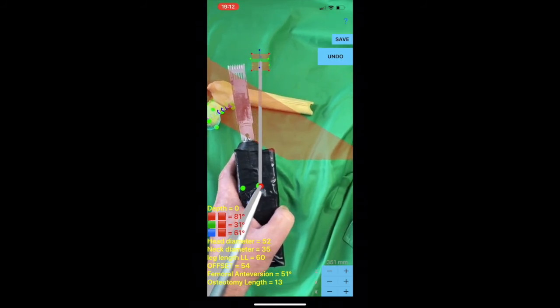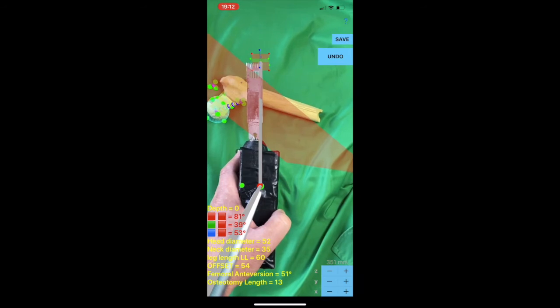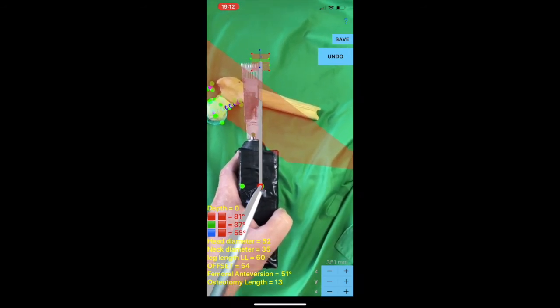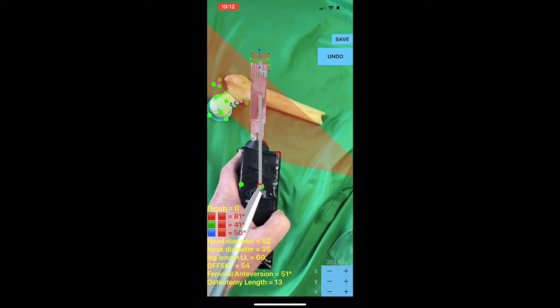Surgeon can view a gray cylinder between two red spheres, rod image superimposed in the real surgical field through the iPhone display mimicking the length of the blade. The direction of the iPhone case with the rod should be turned manually clockwise or counterclockwise and adjusted accordingly, so the gray cylinder between two spheres shown in AR should be aligned with the axis of blade saw in the middle.